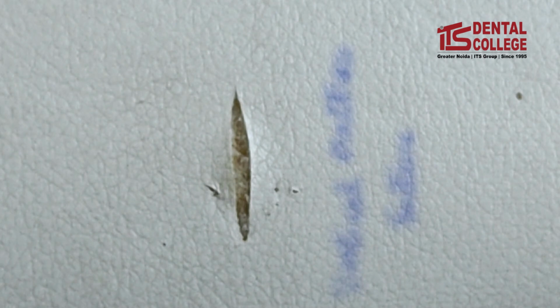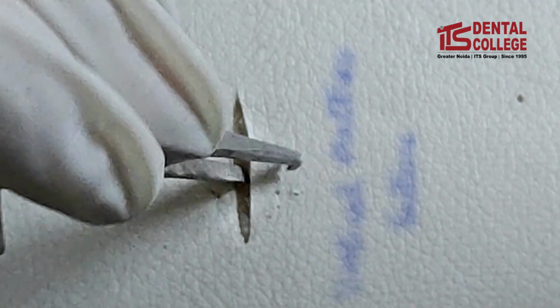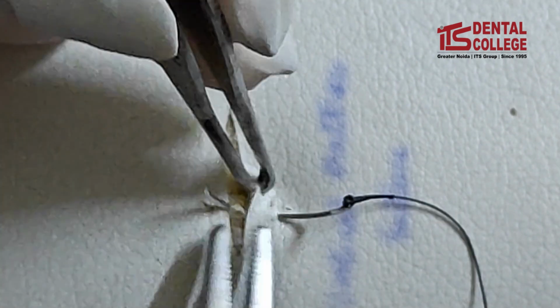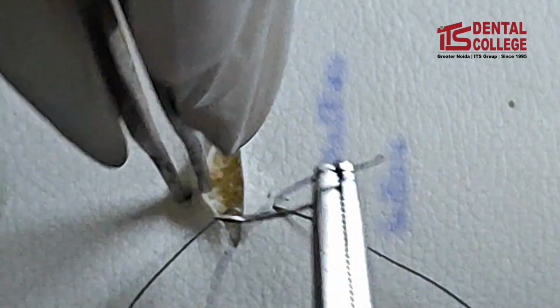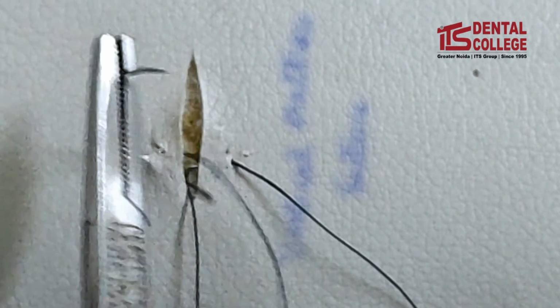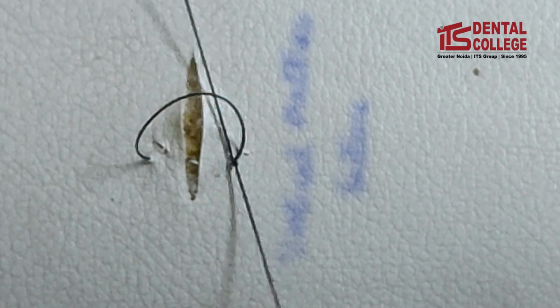The next suture will be simple continuous suture. So as we had seen in simple interrupted suture, we will again take the first bite from the buccal aspect. The next bite will be taken from the palatal aspect. And similar to simple interrupted suture, we will tie the knot.